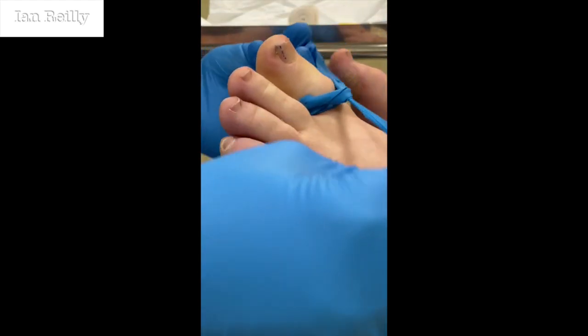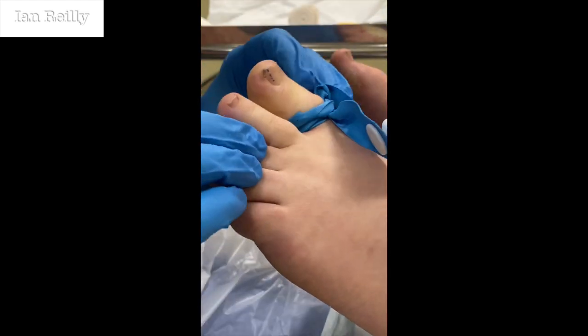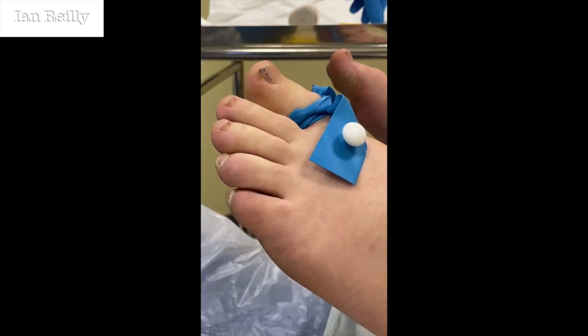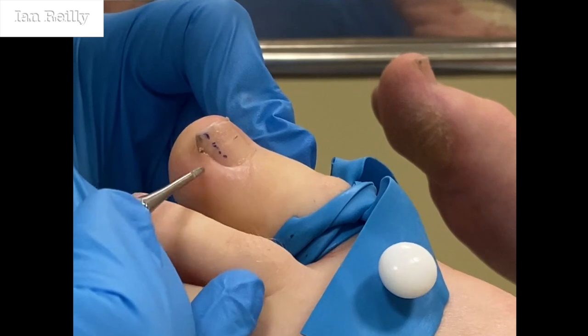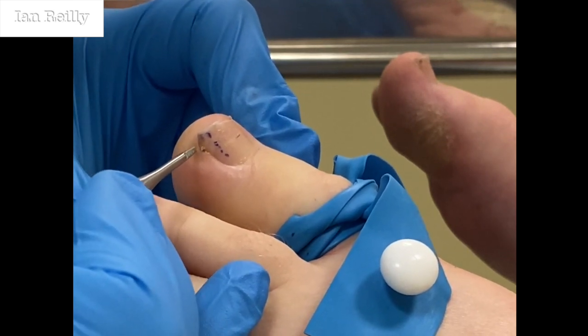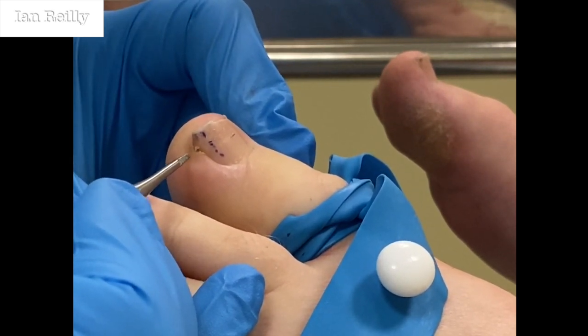Okay, get that out of the way. So what we're going to do, guys, it's really going to be kind of a hemi-VANDENBOS. You can see that Sophie's really got quite a lot of, well, I suppose a hypertrophic tissue.